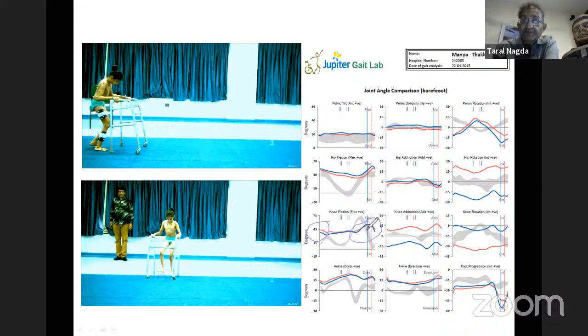In this case, on clinical evaluation, we found that rectus was not tight. But there were a lot of rotational issues, and this problem, which was apparent, the decrease in peak knee flexion, was a result of a rotational issue in that child, and weakness, very slow.